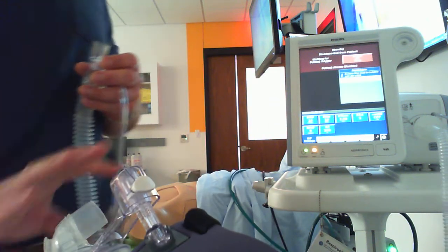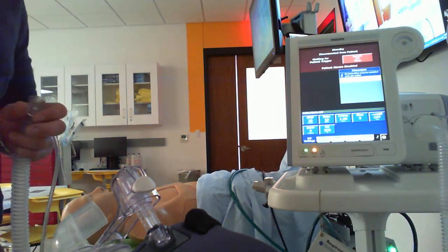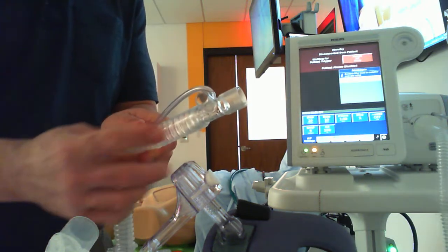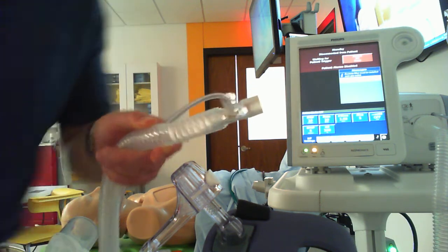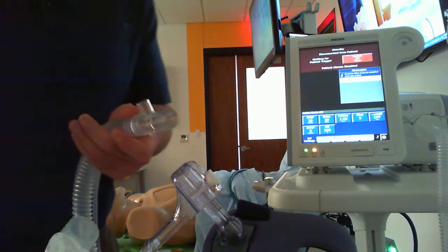The one thing I would recommend, and I would add this on just because it's going to be part of our competency, if you're getting ready to do a nebulizer after initiating, you would want to think about placement. Remember to get optimal deposition to your patient. For a single limb circuit, we do need to place the nebulizer distal to this exhalation port right here. All right. If you had a vibrating mesh, so an Aerogen, that would be the best way.